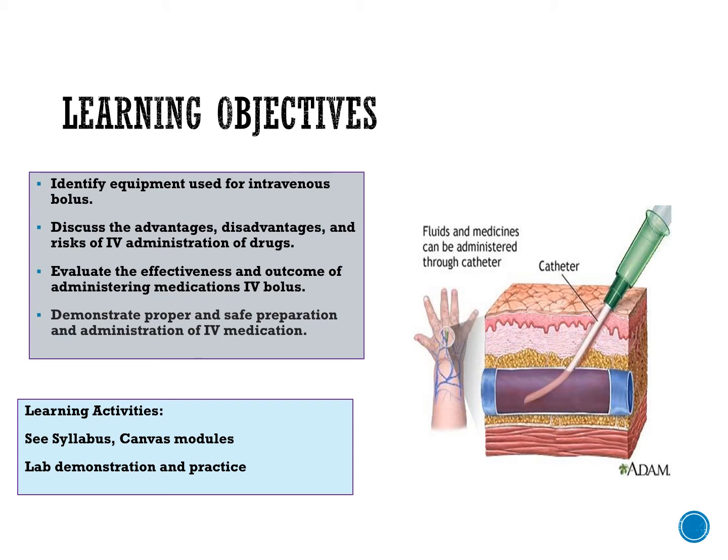The image that you see on the right side of the screen is what an IV catheter looks like when it's inserted into a vessel. You can just see the catheter. It's made of a plastic-like material, and it's just kind of angled down into the vein. So this is the route in which the patient receives their medication. It's important that it actually stays in the vein and doesn't end up in the tissues. That would be an infiltration.